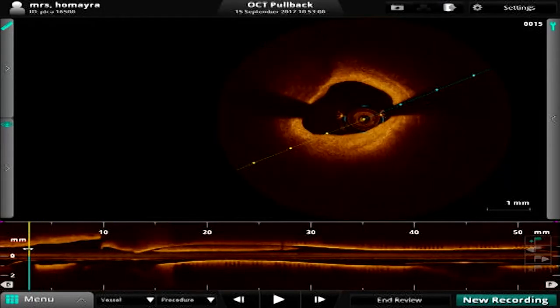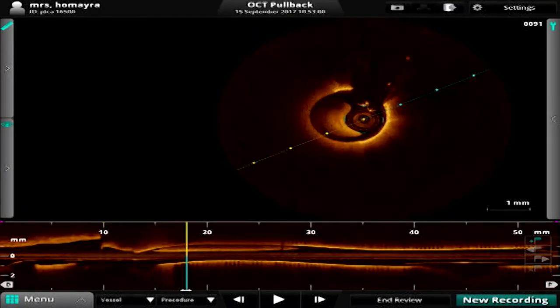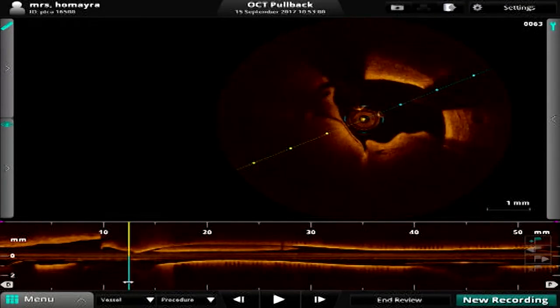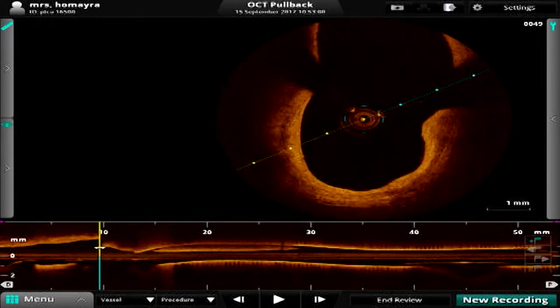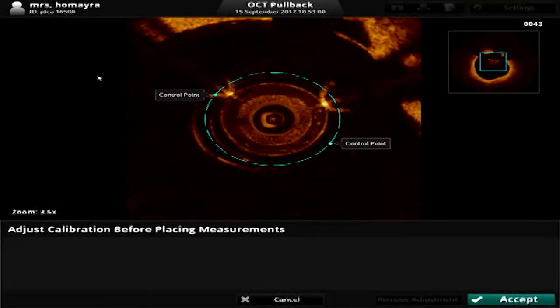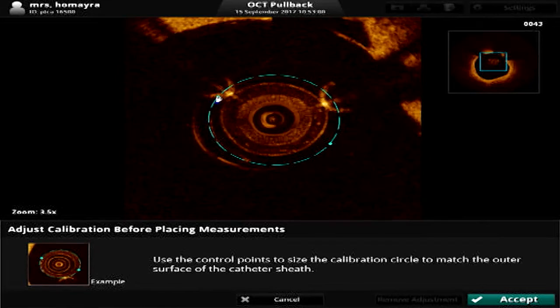Hold it here. This is distal, slightly distal. Proximal. Distal, please. So we'll take a 3.5 into 18 BRS, yeah? You have a dissection right at the origin of the diagonal. You need to stent that. And you have a nice distal landing zone. The placement of your side branch stent was perfect. There are no struts hanging in the lumen, no protrusion.